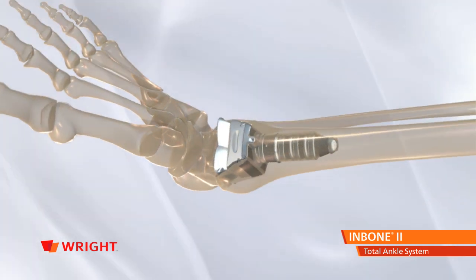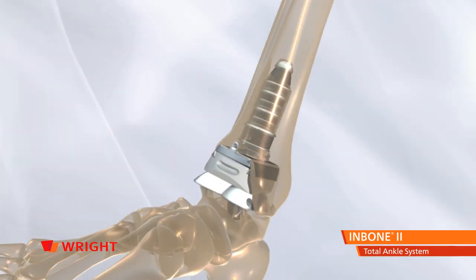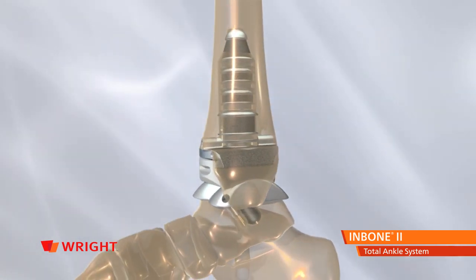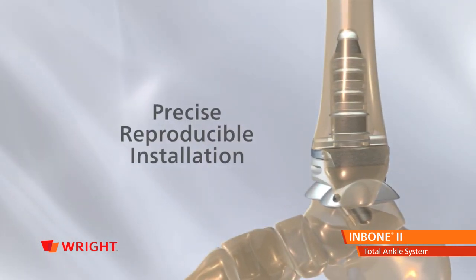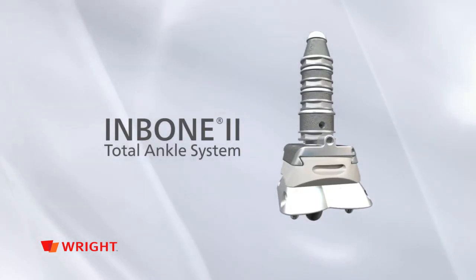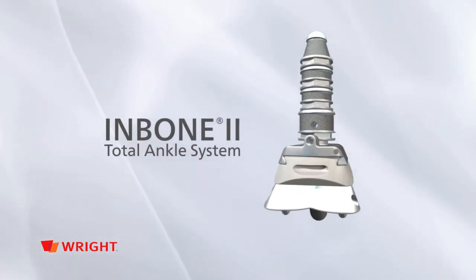The InBone 2 Total Ankle System is a major advancement in total ankle arthroplasty, offering precise and reproducible installation. InBone 2 Total Ankle — the most advanced engineering and technology for total ankle replacement.